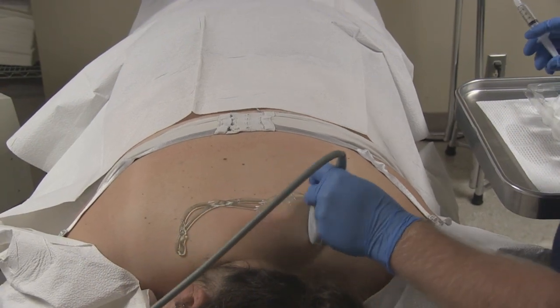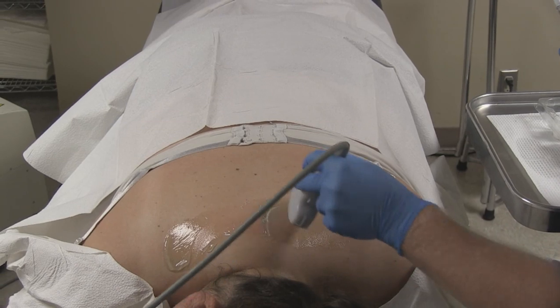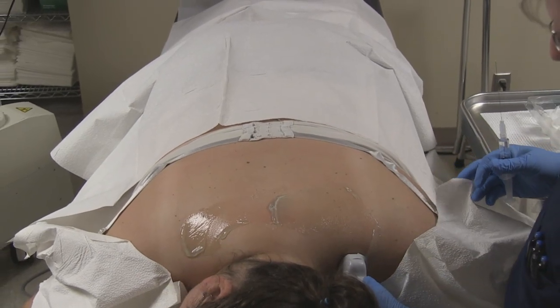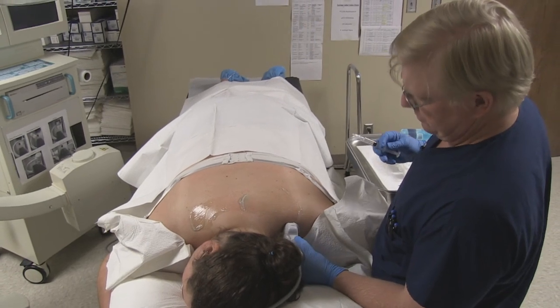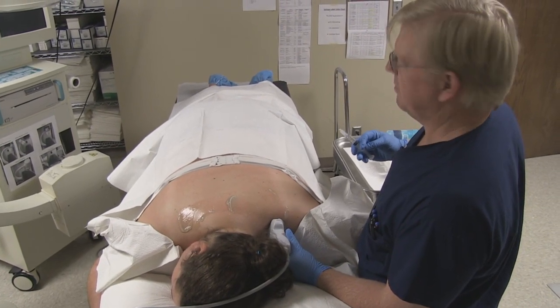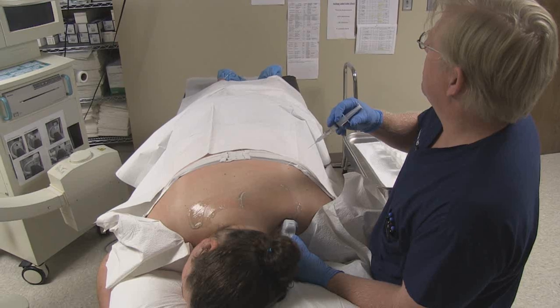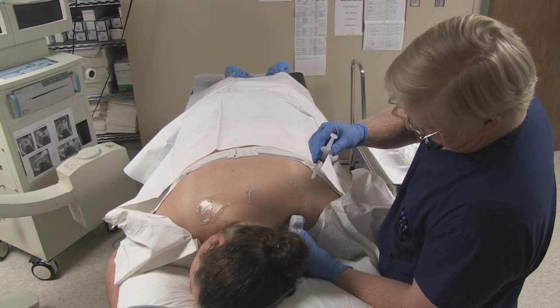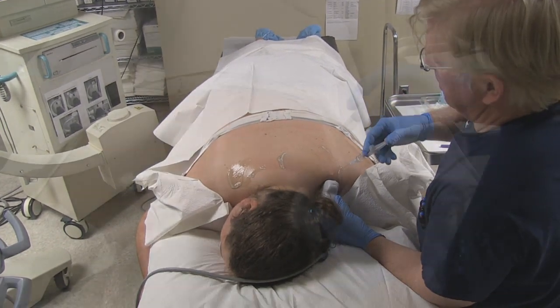We're going to do trigger point injections in our typical spots in the trapezius, using a curved transducer at a little bit lower frequency for the depth of the tissue. Go to 4.7. Our goal here is actually to see the trigger point release. We have a 25 gauge 3.5 inch needle and we are using 1% lidocaine.